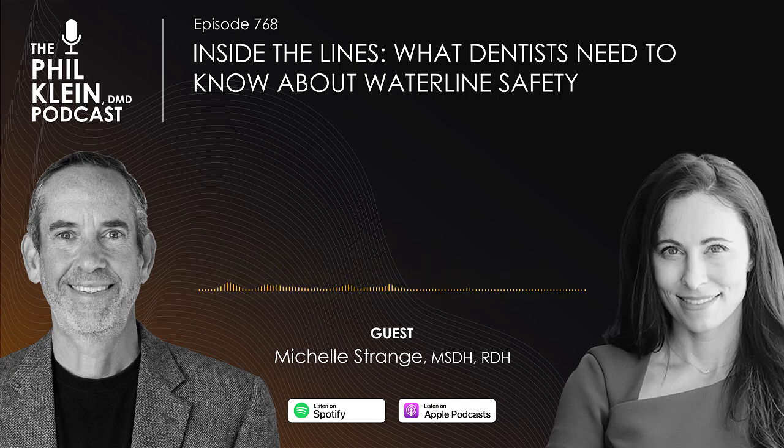We probably just had municipal water coming in. But it's still, anyway, a confusing topic. So I do think that this is a great time to clarify some nuances to this because there are people that are going to have their dental units tied into city water, and some people will even have the city water go to a bottle system. I had that for years. And then some will just be a bottle system. And so what I mean by that is the actual bottle that you can pull off the dental unit and fill with your desired water, usually tap water.